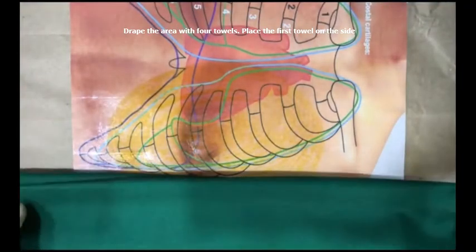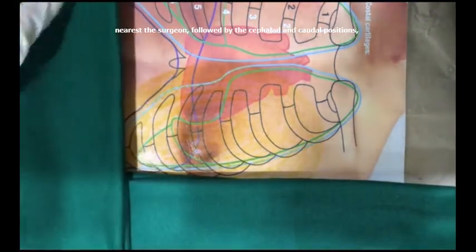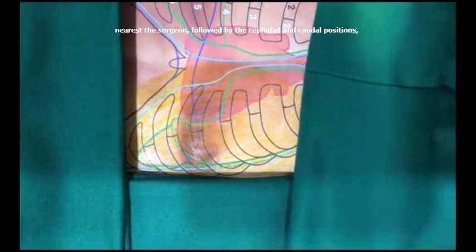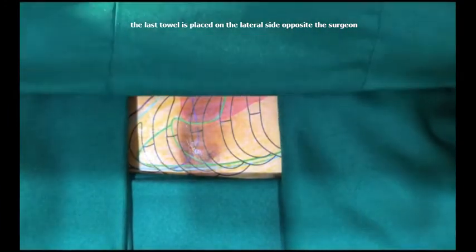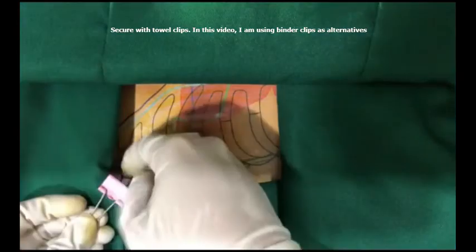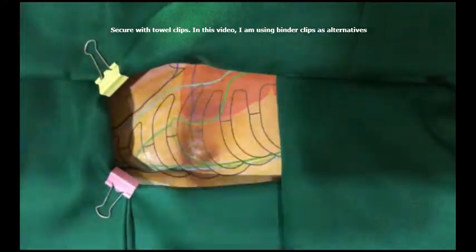Drape the area with 4 towels. Place the first towel on the side nearest the surgeon, followed by the cephalad and caudal positions. The last towel is placed on the lateral side opposite the surgeon. Secure with towel clips. In this video, I'm using binder clips as alternatives.